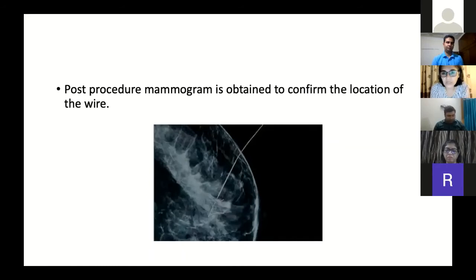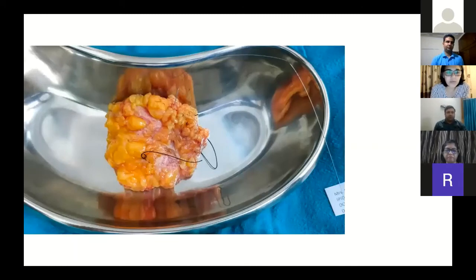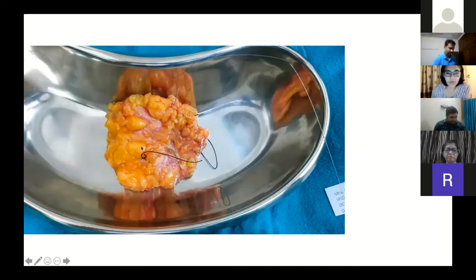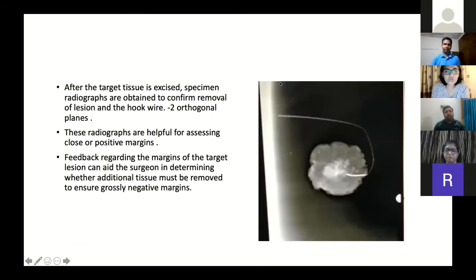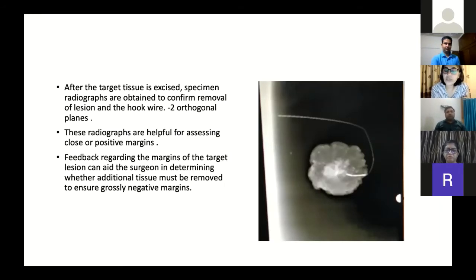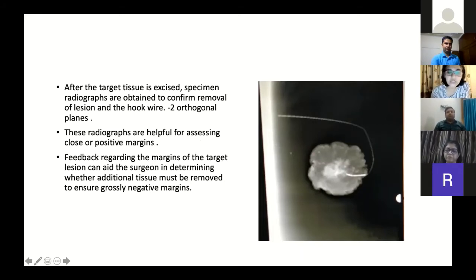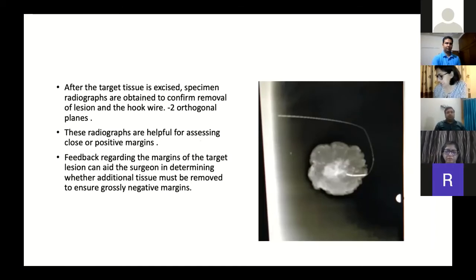A post-procedure mammogram is obtained to confirm the location of the wire — this is a must. This is the operative specimen; as you can see, the wire is very much inside. This was a small invasive carcinoma. After the target tissue is excised, specimen radiographs are obtained to confirm removal of the lesion and the hook wire; we typically do two orthogonal planes. These radiographs are also helpful for assessing close or positive margins. Here is the speculated mass with the guide wire inside. Feedback regarding margins can aid the surgeon in determining whether additional tissue must be removed to ensure grossly negative margins.